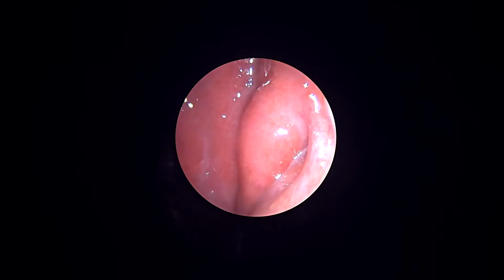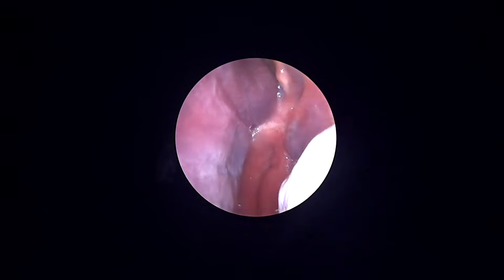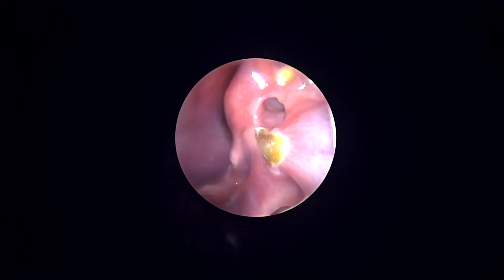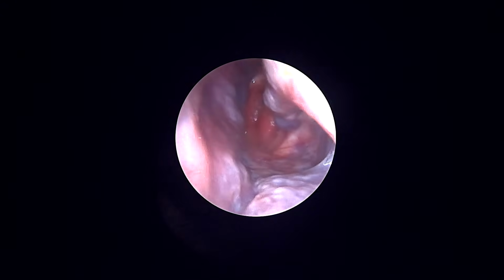The histopathological examination of this mass was inflammatory polyp. That inflammatory polyp explains why this polyp was looking congested or looking more like a mass. It can mimic some tumors. This is the nasopharynx. The patient is completely free of the disease. You can see a glimpse of the maxillary sinus also, which is open.